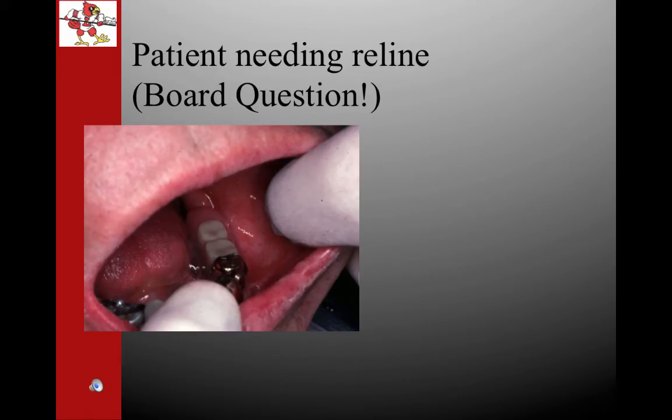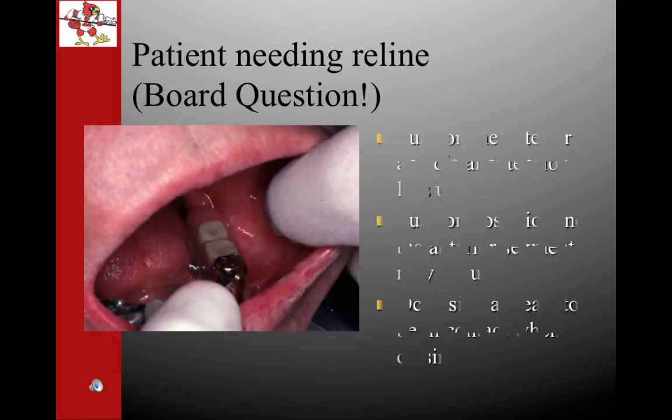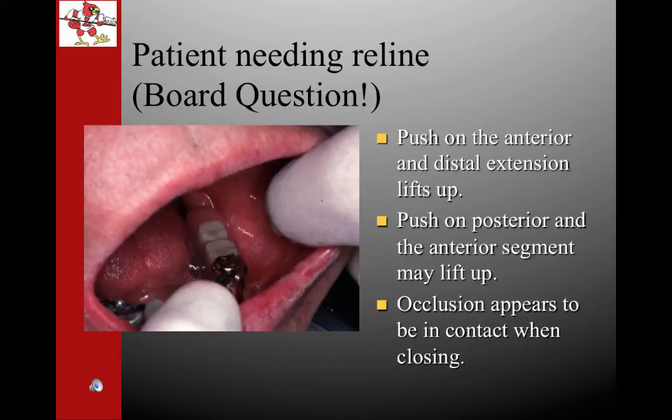A board question that was asked previously was, how do I tell if the patient needs a reline? The answer was, push on the anterior flange of the RPD and the distal extension lifts up. Push on the distal extension of the denture and the anterior segment lifts up. It may appear that the patient is still in occlusion when you have the patient bite down. That is not a determinant of whether or not it needs a reline, because as the partial settles, sometimes the tuberosities settle and it looks like the patient is still in occlusion. Chances are, though, the indirect retainers are up off of their rest seats.